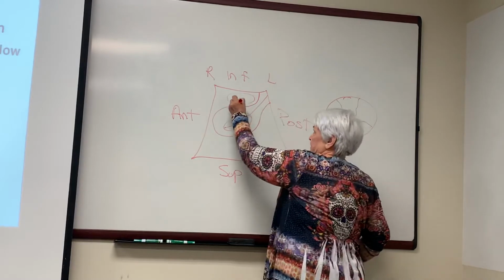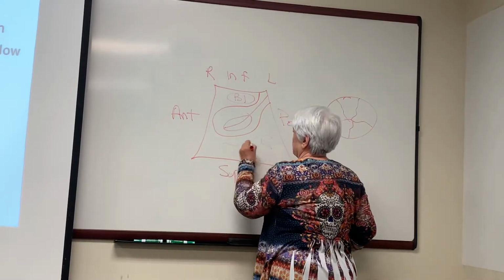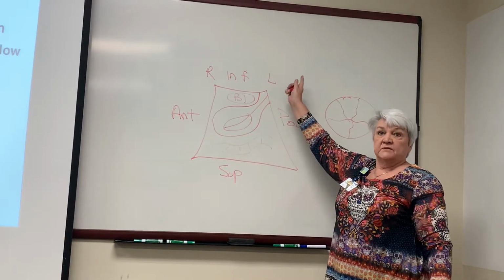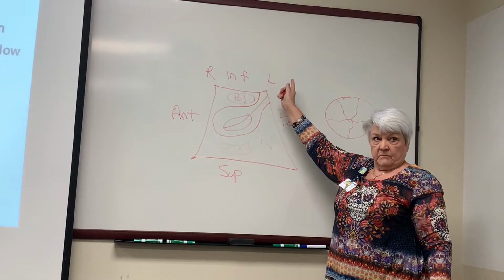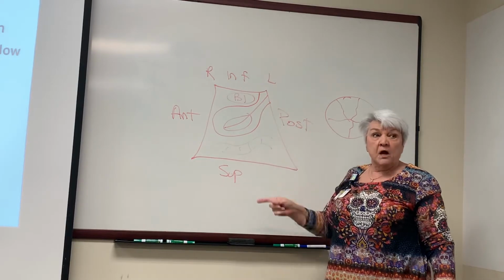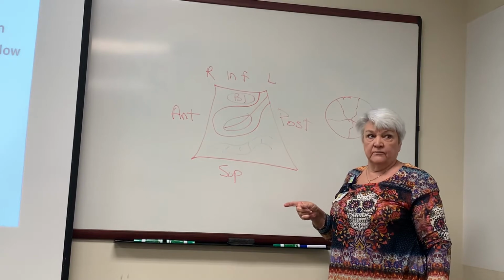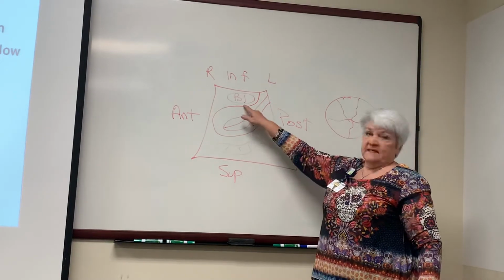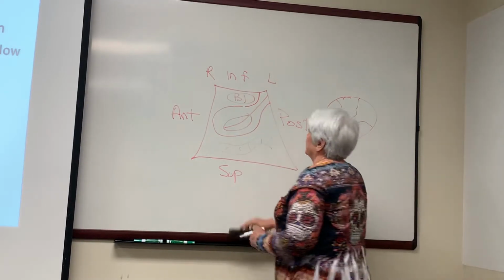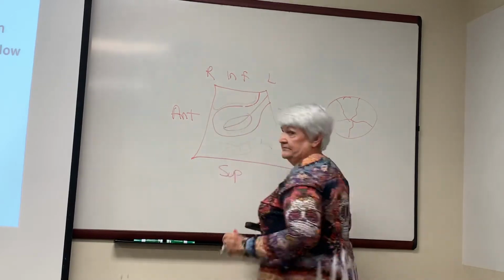This is my bladder. Okay? Here's my rectum. Okay? So it's going to be top left screen. Okay? Now with first trimester, you want a full bladder. Okay? You want a full bladder. This is not a full bladder. Okay? This is a full bladder.